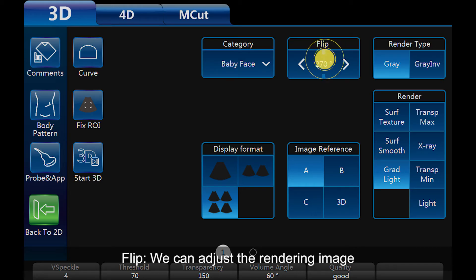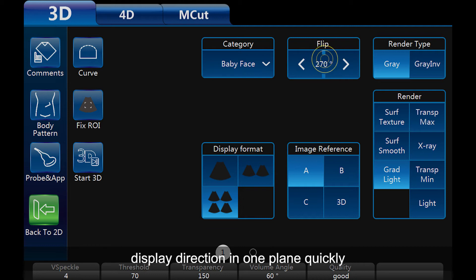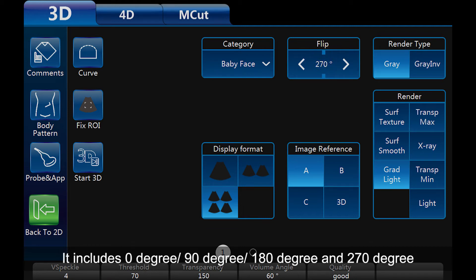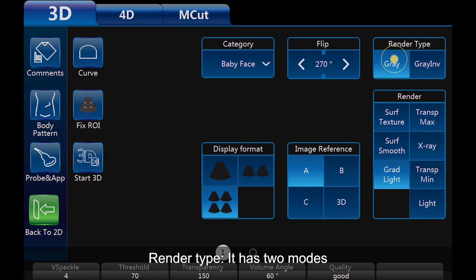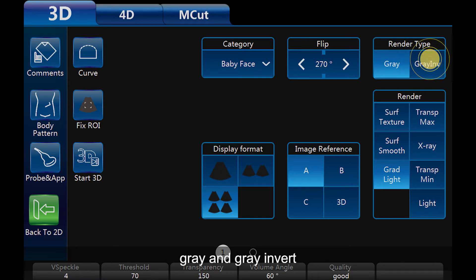Flip: we can adjust the rendering image display direction in one plane quickly. It includes 0 degree, 90 degree, 180 degree, and 270 degree. Render type has two modes: grey and grey invert.